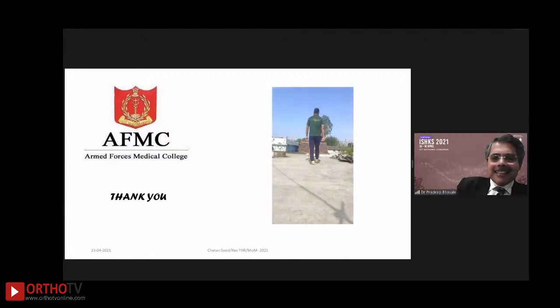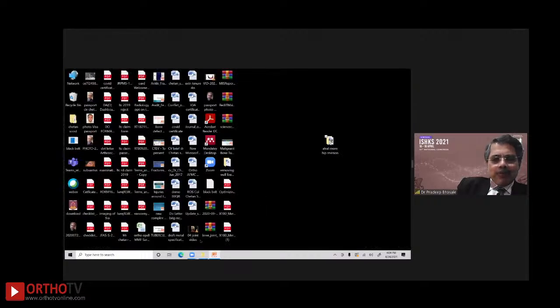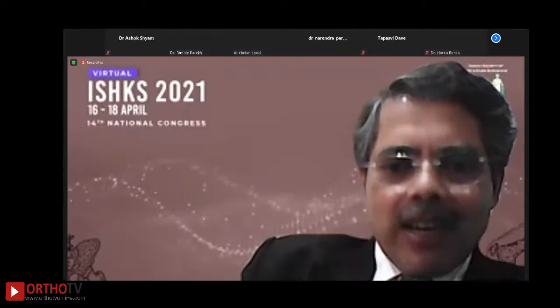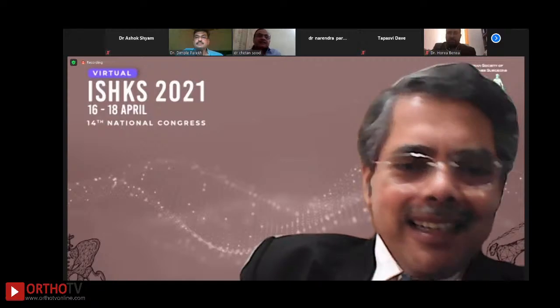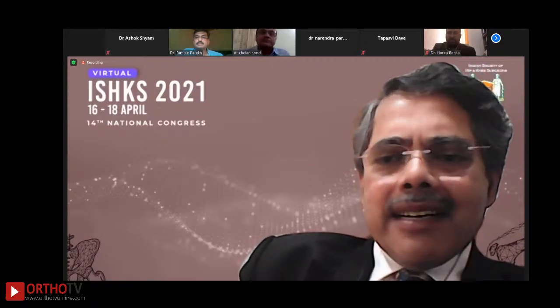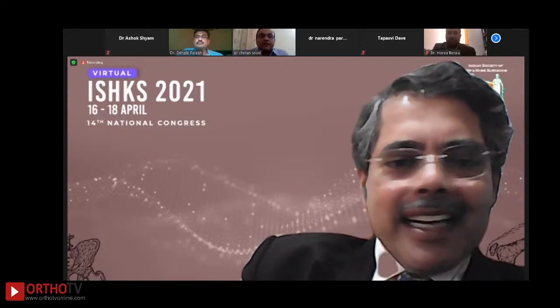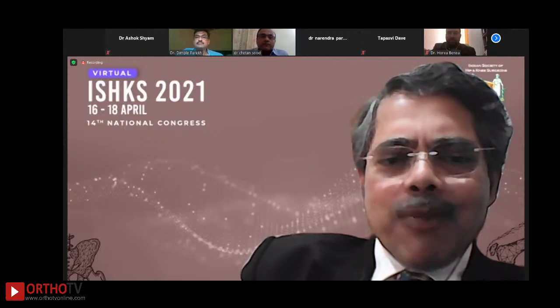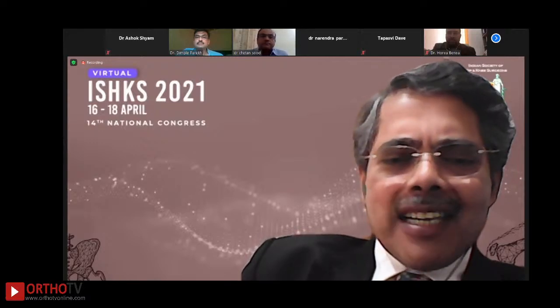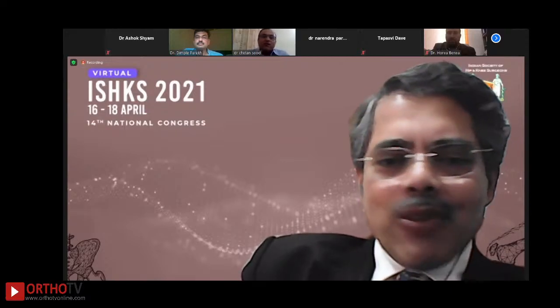Fantastic case. It has worked out very well. You have done wonderful surgery and the pre-op planning was superb. You have done a wonderful workup and demonstrated the osteolysis. And there's only one option, only revision. Don't look at the opposite side. And only one small thing, you could have used a little longer stem for revision. But anyway, it was holding well.